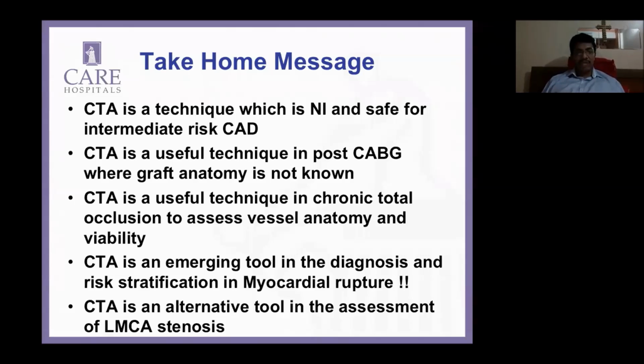I think it's very important that you don't need to know how to do a CT, but it's very important to know how to interpret CT data. I think that's very important, and it puts a lot of onus on us, not leaving it to radiologists and the like, because then they get to tell you whether the patient has disease, no disease, and things like that, which I think is our domain.